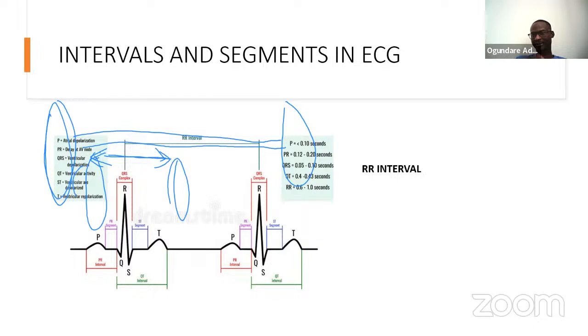And even without palpating your patient, just from a distance, you're going for your break and you just catch a glimpse and look at the monitor and you can actually come back and say there's something going on with this patient. And that's the essence of this series, so you can be a viable, a potent lifesaver.